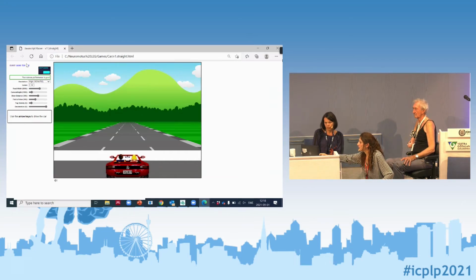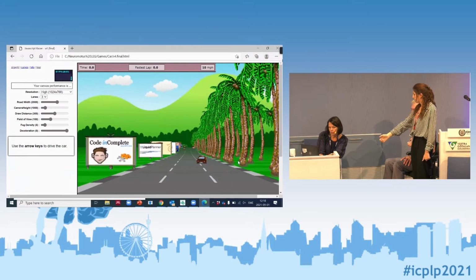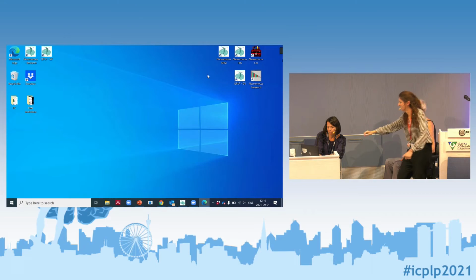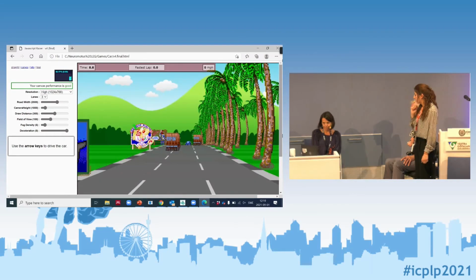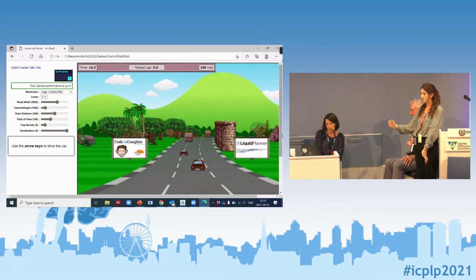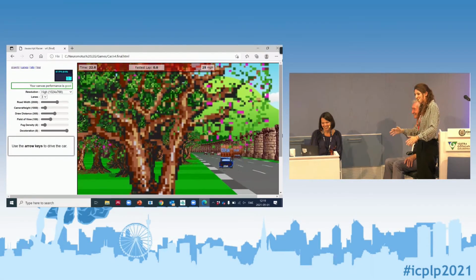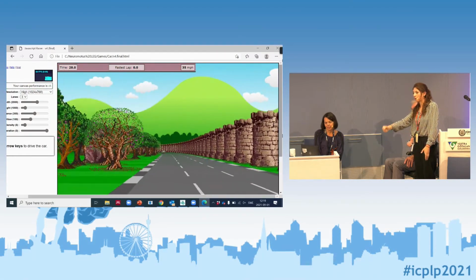So we will put a final here. So can you please first? Yes, exactly. And now can you brake? And you stop? Exactly. So now we are controlling. What happened? We open here. Don't worry. So now, with the flex, the car accelerates, and if he extends, the car brakes. Now can you open? Oh, you're going super fast. So you drive too fast. Yeah. Slowly. Now, for example, if you close your hand, excellent. So we close and we go back to the road, excellent.